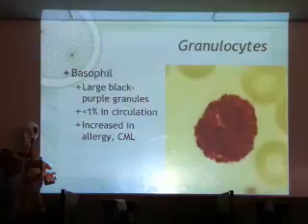Okay, the next granulocyte I'm going to show you also has a very obvious feature of lots and lots of granules in the cytoplasm, so that's why I use this for the next example. But this one is even more rare to find in circulation normally. These are called basophils because these granules like the basophilic dye, methylene blue. That's why these granules stain very, very dark. Your textbooks will tell you the granules are dark purple, but it's more like almost black, and they look kind of like charcoal.